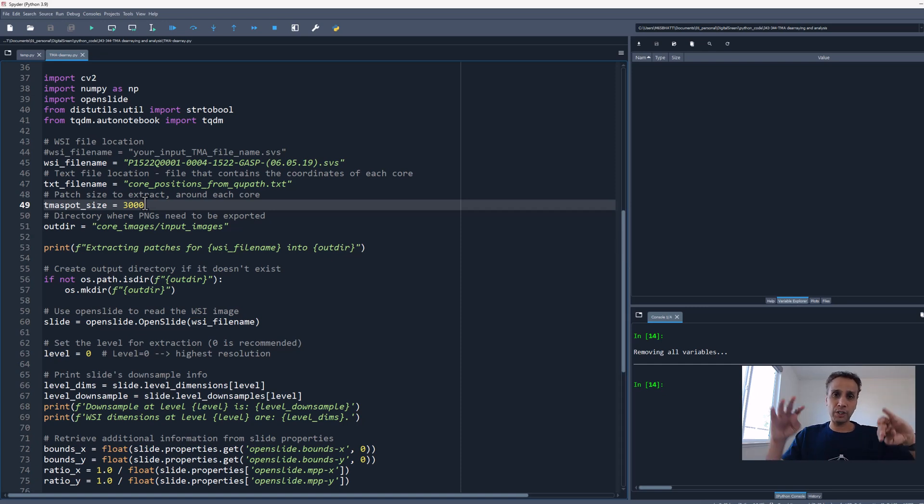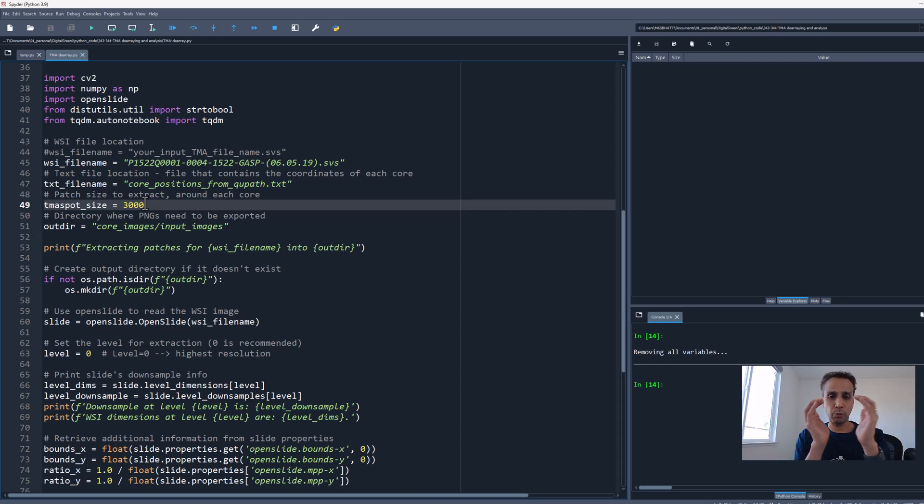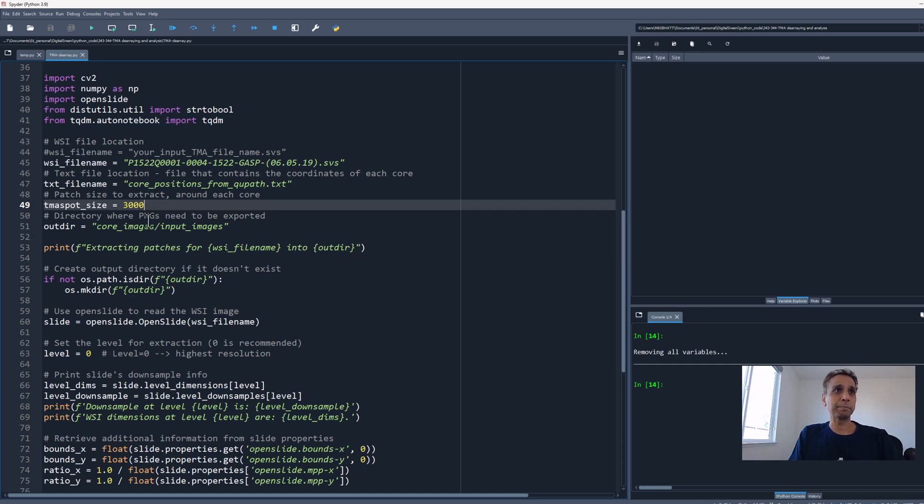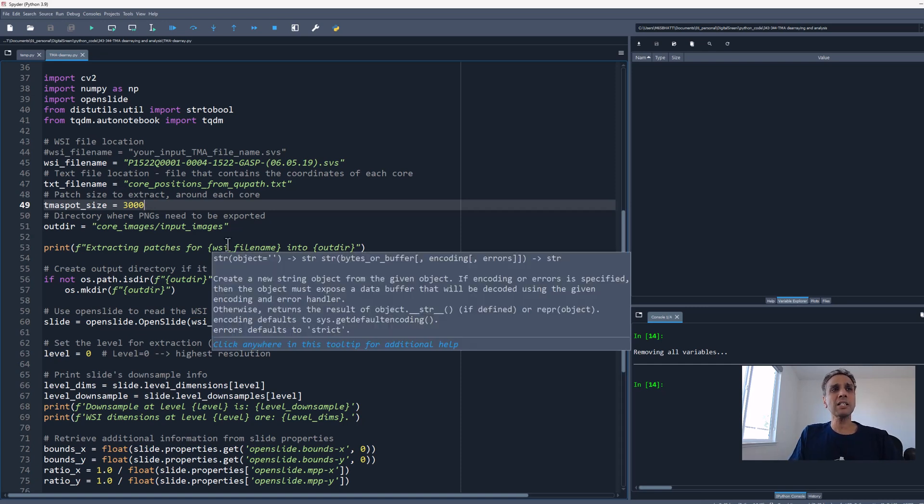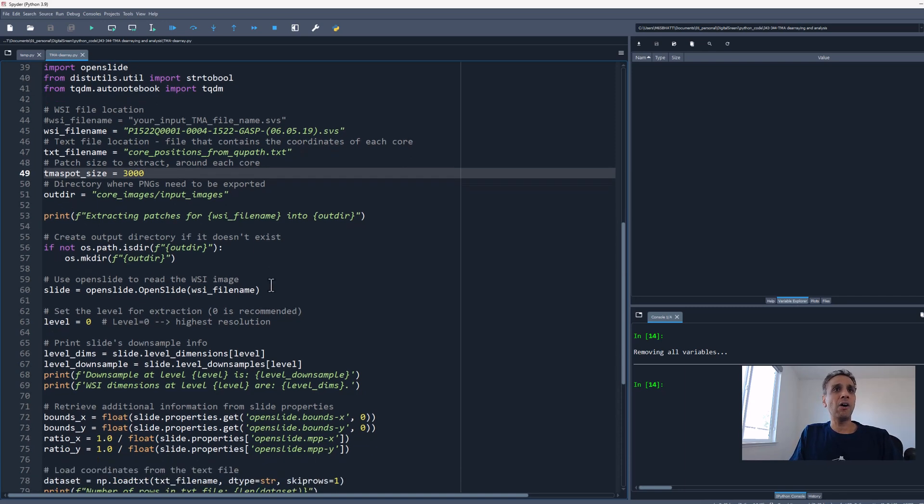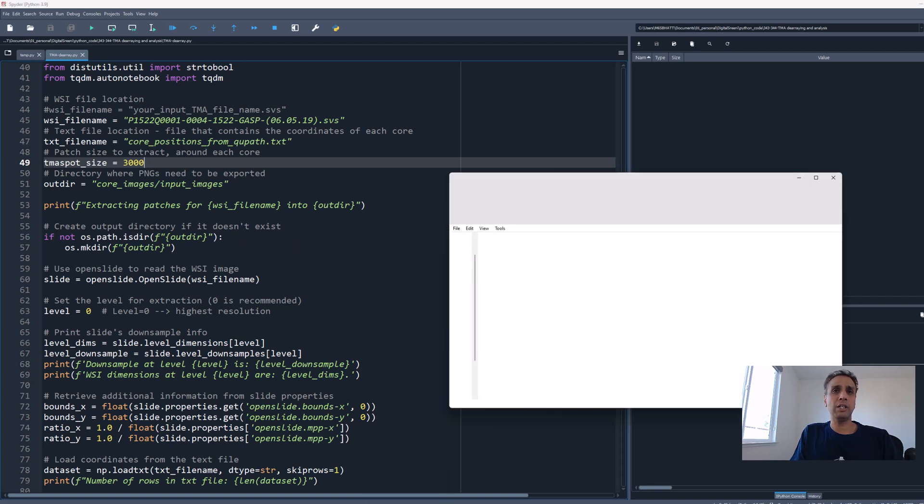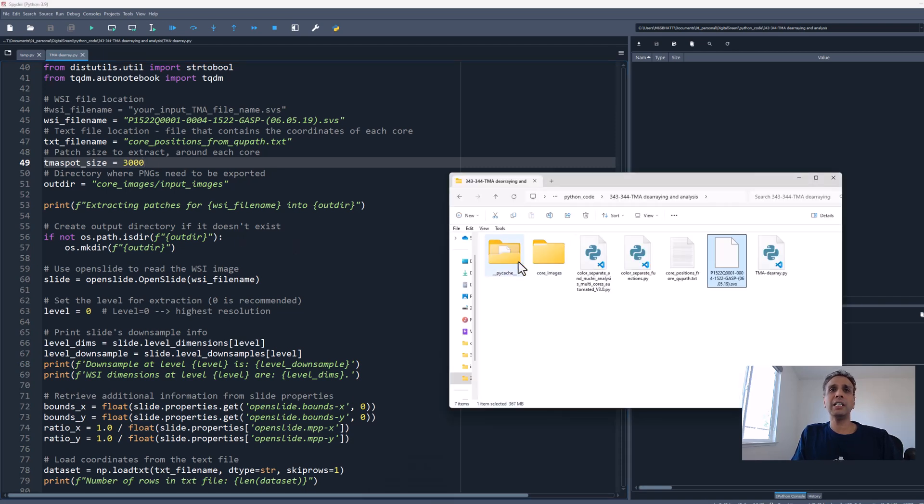I started with 5000 pixels but started seeing edges, some pixels from surrounding cores. I just want 3000 pixels where I have the core. This is an experiment you have to do on your own SVS images. Here's my output directory where all the patches are stored.